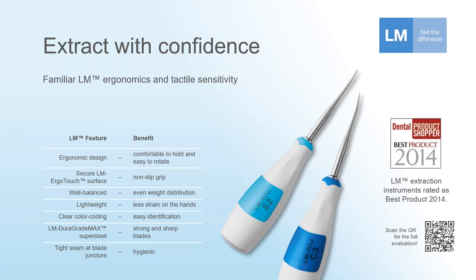The overall weight of the instrument is well balanced and very light. Most practitioners, when they first come in contact with the LM extraction instrument, are surprised how light they are. In one extraction that may not be a huge deal, but if the procedure is longer or there are more extractions, that can really add up.